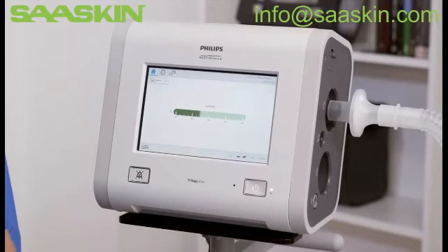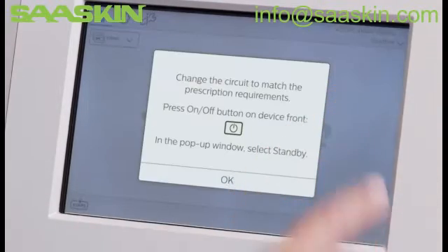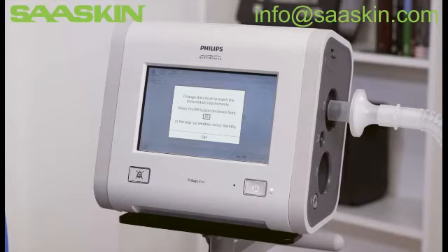To change prescriptions, tap the current prescription in the top right corner and then choose the new one. Read and follow instructions in the dialog box. In this example, the circuits are different — they are both passive, but one has active humidification and the other does not.